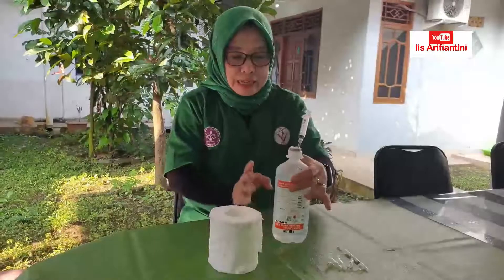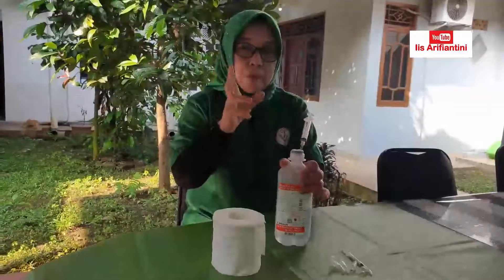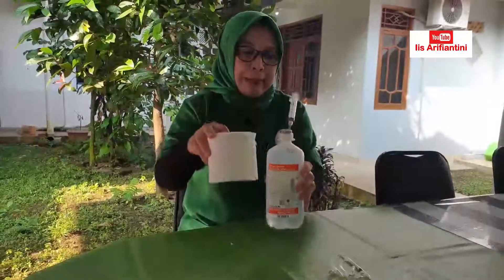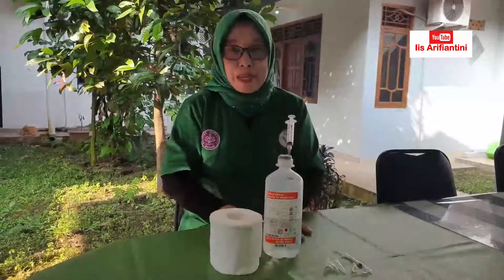Alat yang tadi kita butuhkan juga adalah bahan NaCl fisiologis. NaCl ini diperlukan untuk membilas kloaka. Kita tahu bahwa kloaka itu di dalamnya ada tiga saluran: ada untuk semen, ada untuk kotoran, dan juga untuk urin. Sehingga kita harus bersihkan dulu sebelum kita massage. Jadi kita butuh tisu juga untuk mengelap NaCl, dan ini semua hal yang dibutuhkan untuk menampung semennya.